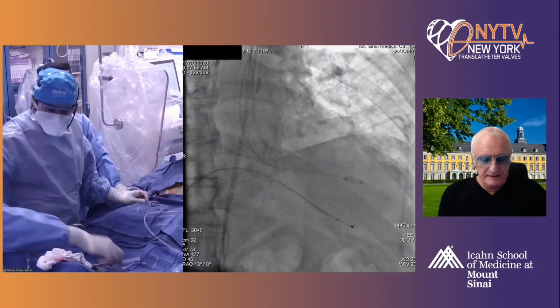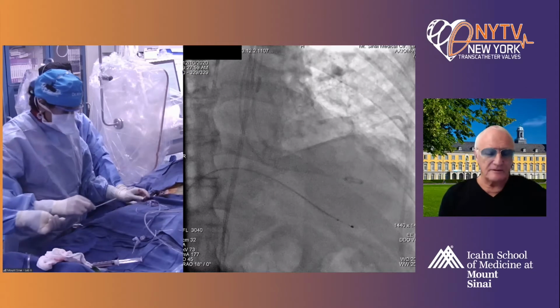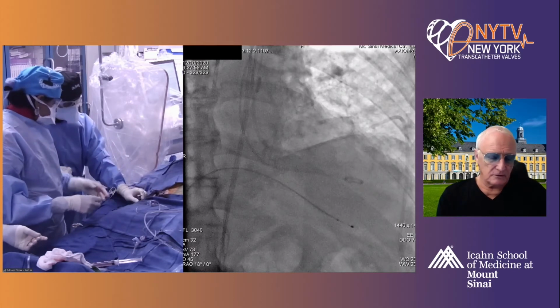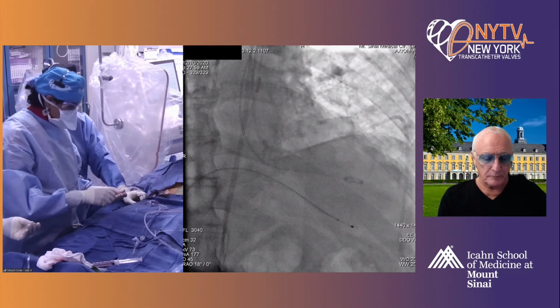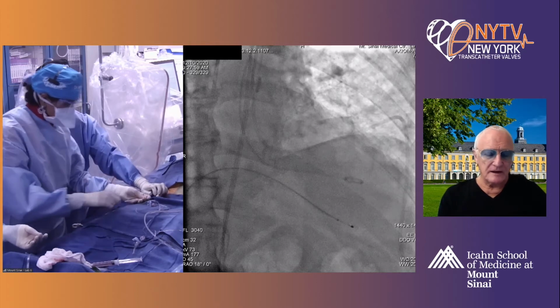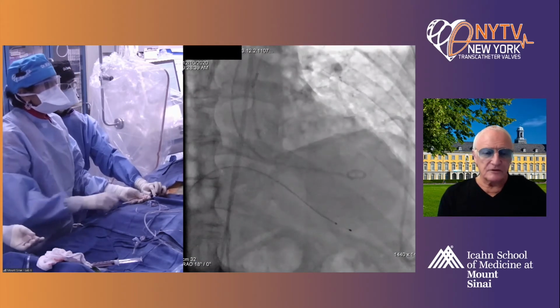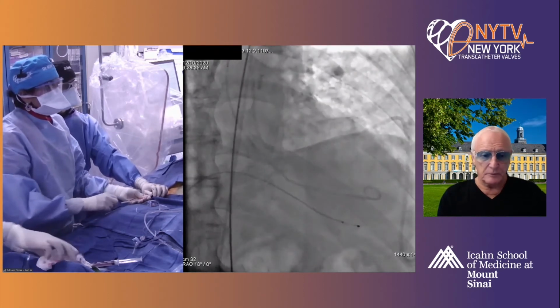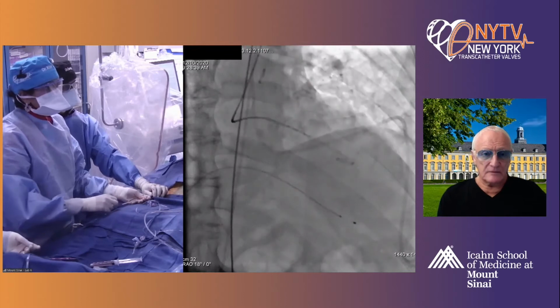Yeah, thank you, Rox. And I agree with Didier. I think you can choose whatever valve you want to choose, and the 29 Edwards is probably appropriate. The question to me comes up, and I might disagree with Didier on that, because there's still the jury out on what's the best sizing method. There have been many of them proposed. I don't think we have a clear message.